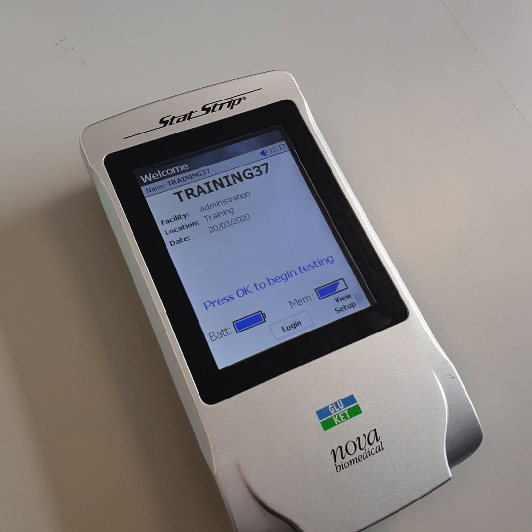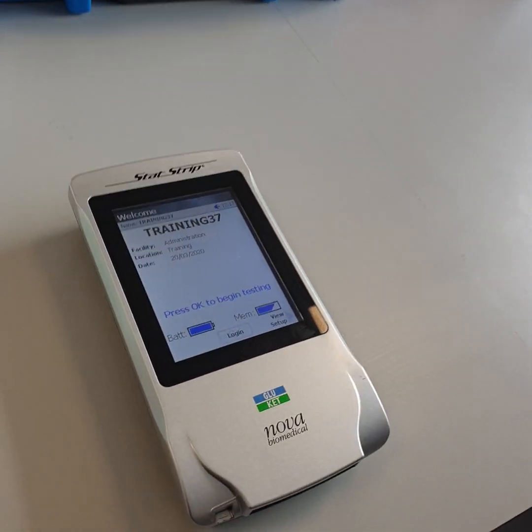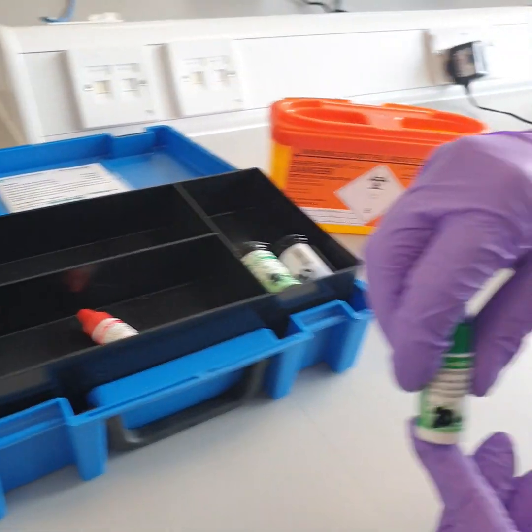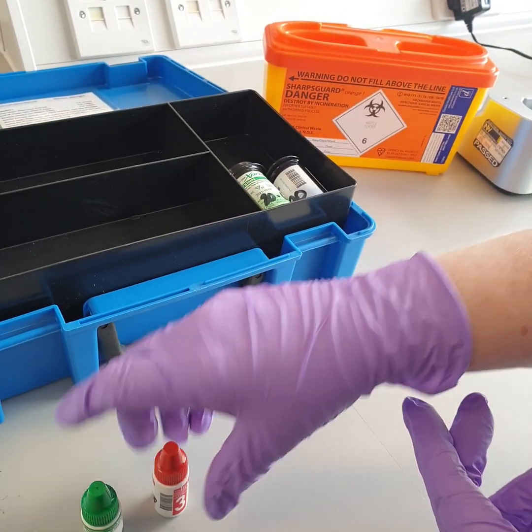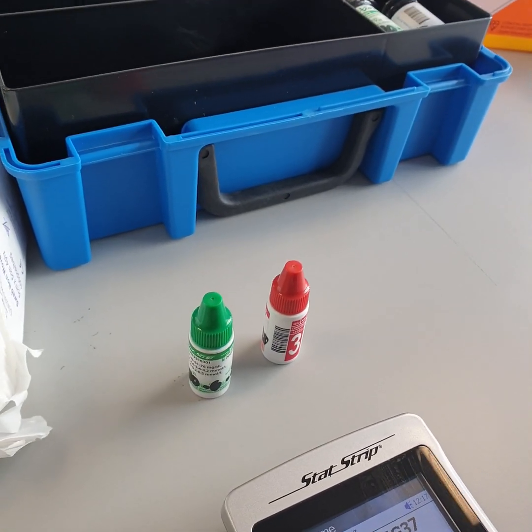To perform this test you need a valid barcode and you should wear the correct PPE. You need the following contents from the glucose meter box: Level 1 QC, in the green bottle, that is in date; and Level 3 QC, in the red bottle, that is in date. These QC solutions are stable for three months from date of opening and the expiry date should be written on the bottle on opening.